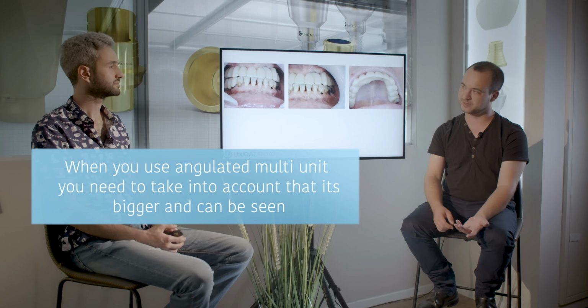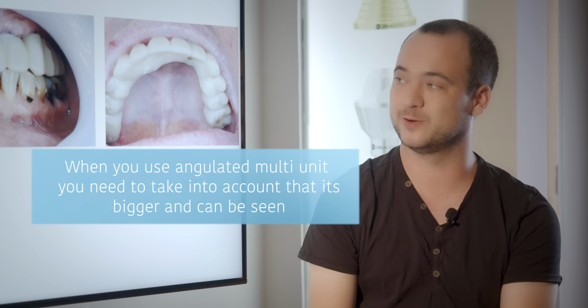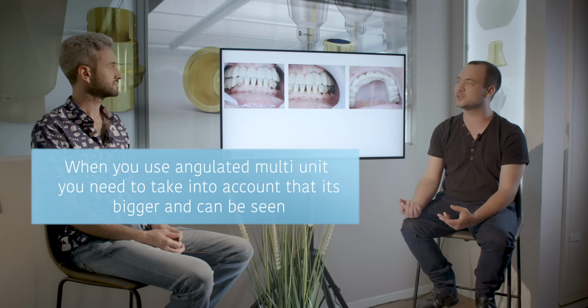You can see that you have, from the start, quite good occlusion. This is without touching anything. You see the teeth are exactly as we placed them. You can see the angulated multi-unit, like we said. We used an angulated multi-unit, but you still see a little bit of the metal. You have some compromise when you use angulated multi-units. On the one hand, you don't want to have the screw channel going out of your frontal teeth, and on the other hand, you don't want to have this.